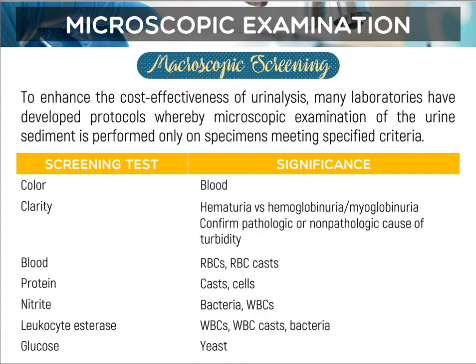Okay? Alright, so microscopic examination also has your macroscopic screening. This is to enhance the cost effectiveness of UA. Many laboratories have developed protocols whereby microscopic examination of the urine sediment is performed only on specimens meeting specified criteria.